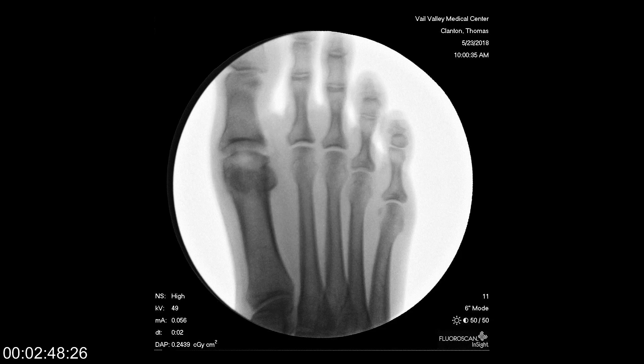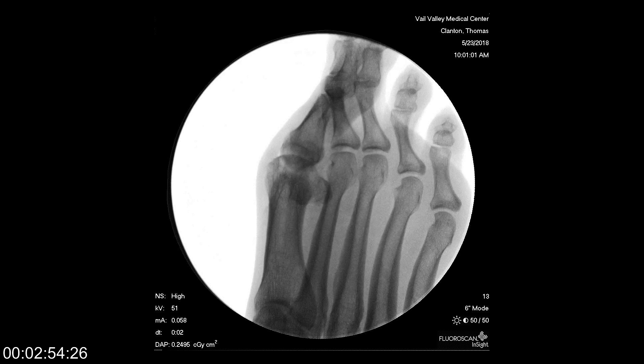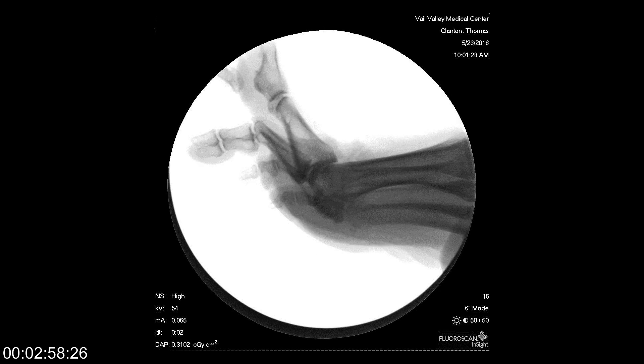This is what the x-ray looks like after the implant has been placed. It restores some joint space back to the joint, and you can see the range of motion that's present.